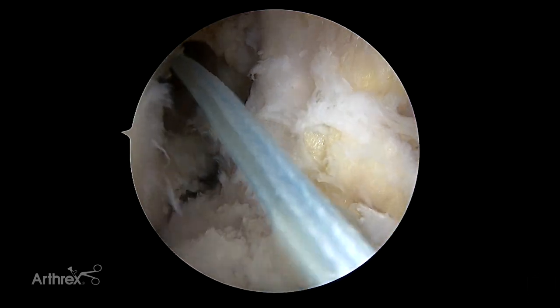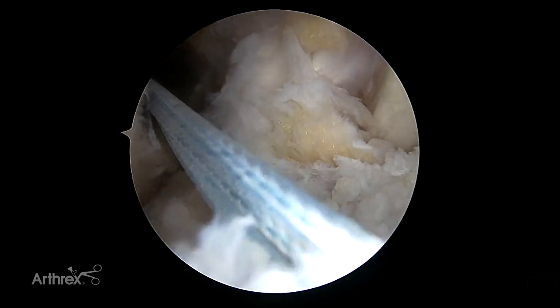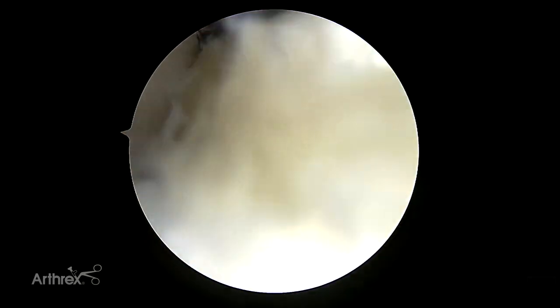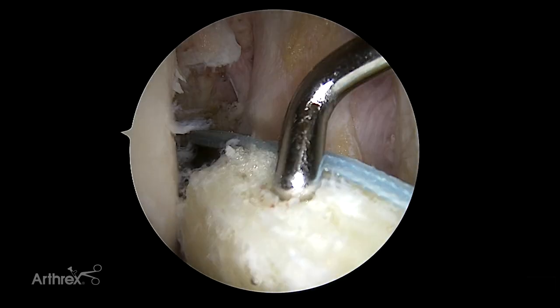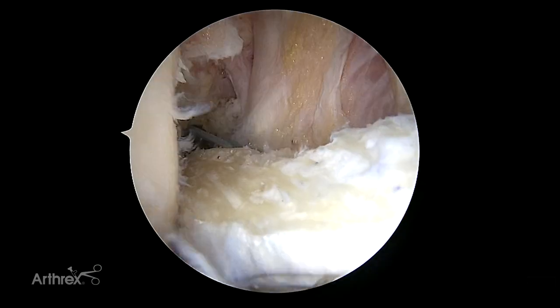At this point, we can shuttle in our bone patellar tendon bone graft. It's important when you shuttle this plug in to pay attention not just to pulling in the plug, but also to the orientation of your plug. As it makes its way into the knee joint, we tend to use a probe or something to orient the bone plug and minimize our chance of soft tissue laceration.